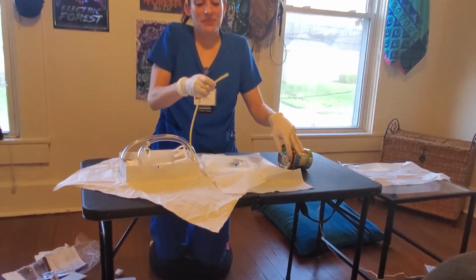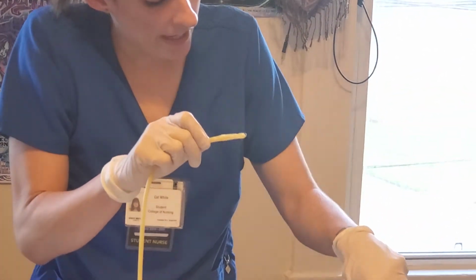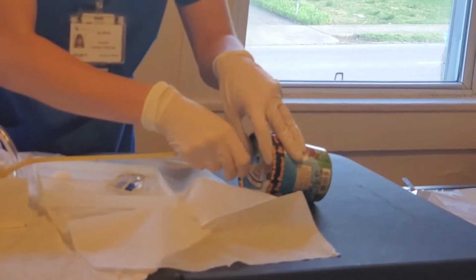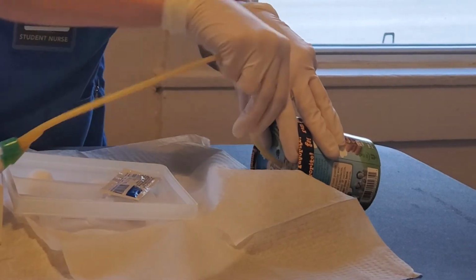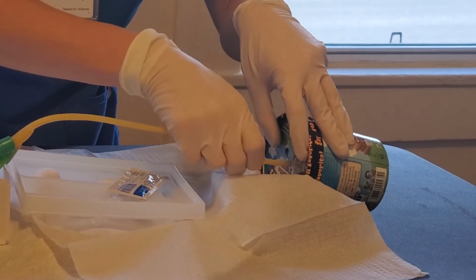We're holding the catheter directly below the balloon. Ms. Hirumi, will you take deep breaths for me while we do this? This will make it more comfortable for the patient. And we're going to insert. We want to insert 3 to 4 inches. But most importantly, we want to continue inserting until we see urine.